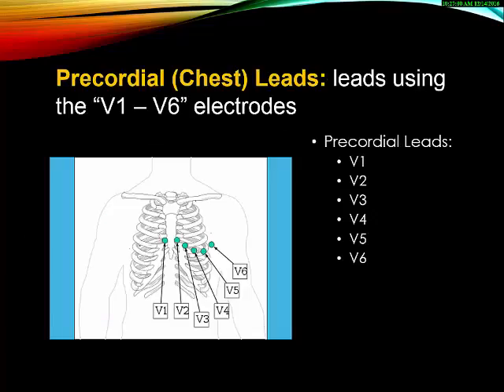Your precordial leads, on the other hand, are the ones that cut the heart in half on a horizontal level. So we're looking at horizontal leads here, and these are your V leads. They're in the positions they're supposed to be in, and we'll talk a little bit about the anatomical positions, but these look at a different plane of the heart. So these are going to look at the plane of the heart that is cutting the body in half this way. Your limb leads look at the front plane of the heart, which would be parallel to your chest.